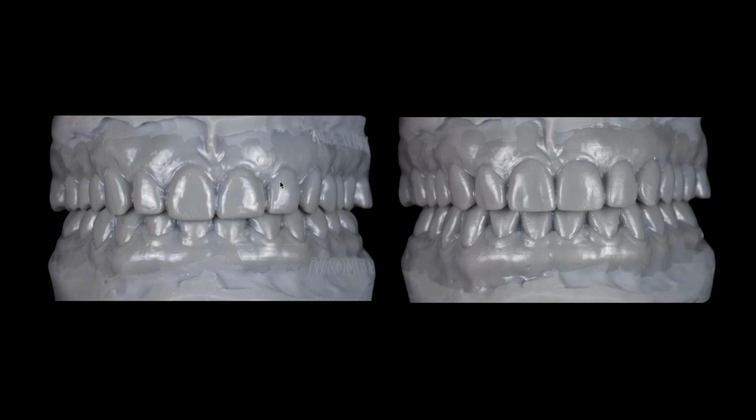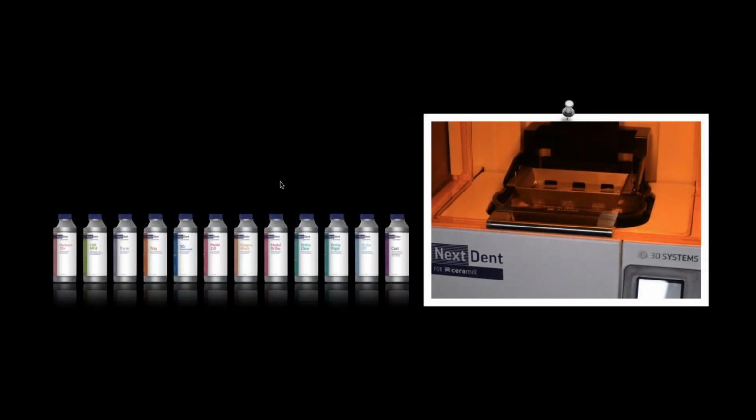And this process is kind of a quick and easy scan for us, and then we can just print out the final sets and send those out to the doctor as an orthodontic cast, so we don't have to mount them on a semi-adjustable. They just go out as two orthodontic self-leveling casts. And that's standard for us.